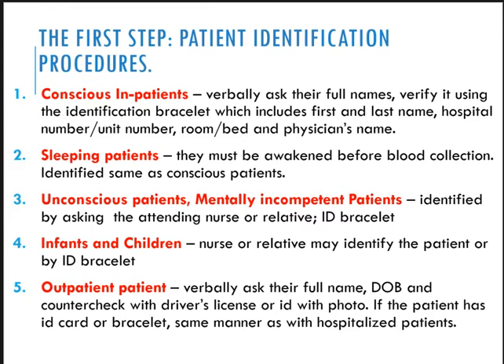Because, for example, let's have a little situation again. When you walk inside the room, and then you go to a random patient's bed, and then you say Farida May Wong, and then gikan pa siya natulog, imo siyang gi-wake up, and then ingka Farida May Wong. So ang mahitabo ana, guys, mo ana radyo na siya, ending dili day to si Farida, lahi day to siya. So, dapat jud, guys, as much as possible, inyo jud siyang pugson na ipasulti or let him or her state good na coming from their mouths iyahang name.